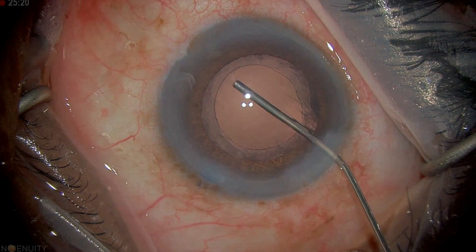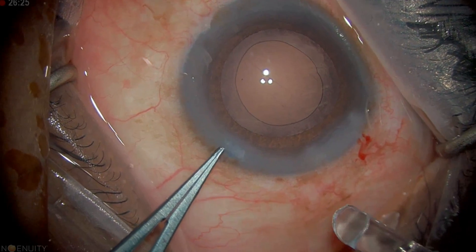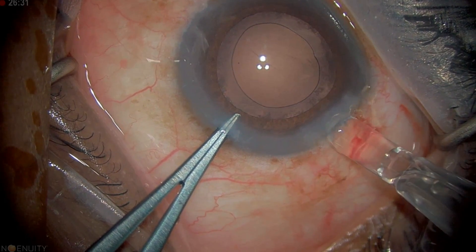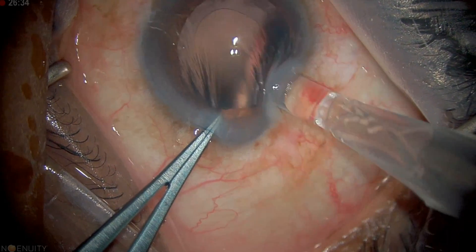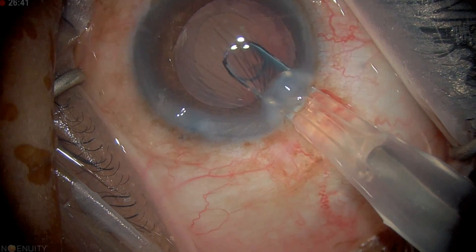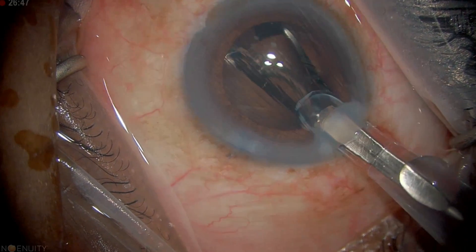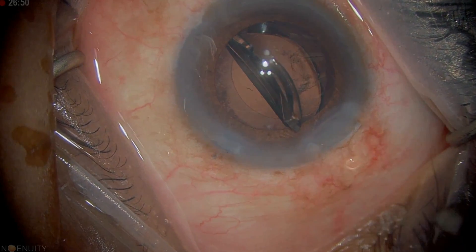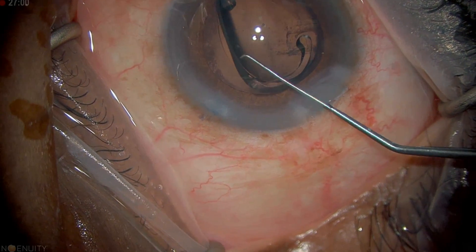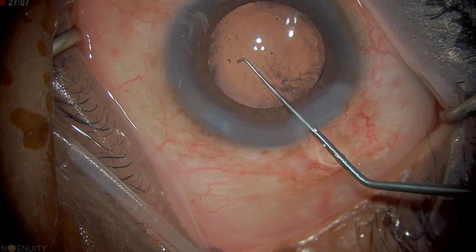For lens insertion we're going to use a cohesive viscoelastic that allows easy removal. We're aiming for plano for this patient. I like to use my 0.12s as counter-traction, placing them into the side port, and then I can put this lens in. It's a big cartridge so it's a tight squeeze — we're just on top of the capsular bag and I'm inserting the lens, actually able to see it underneath the bag. I'll use the Sinski hook to ensure the lens is properly into the bag, making sure the haptics are off the optic.